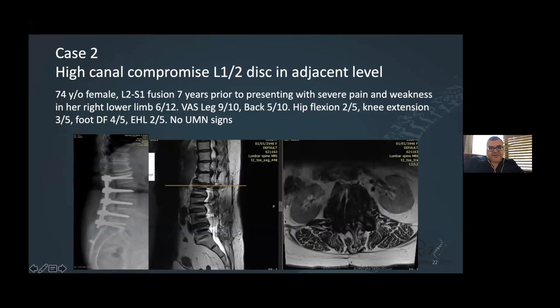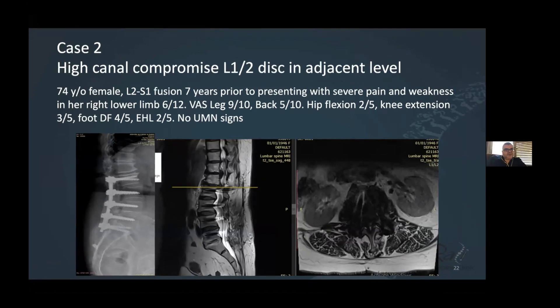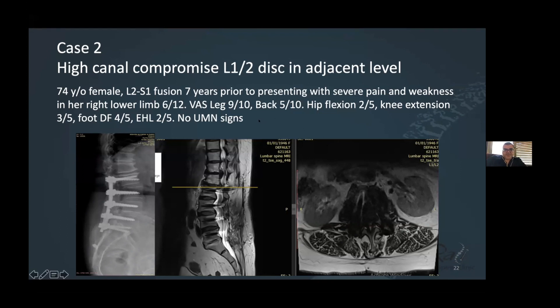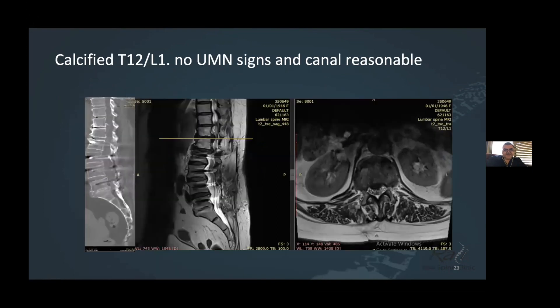The last case is a high canal compromise — a common scenario if you've done enough fusions. This is adjacent level disease in a lovely 74-year-old lady who had a fusion from L2 to S1 done somewhere else six or seven years ago. She has a T12-L1, L1-L2 disc herniation with severe disc degeneration and sagittal imbalance, but she didn't want major surgery. Her main problem was weakness in the right leg — all lower motor neuron, no upper motor neuron signs — which indicated the problem was likely at L1-L2, not T12-L1. And indeed on MRI, L1-L2 shows high compromise of the canal with a huge central disc, while T12-L1 is not actually too bad.